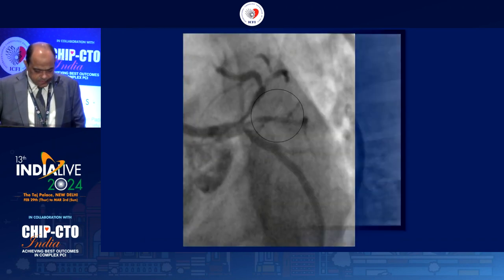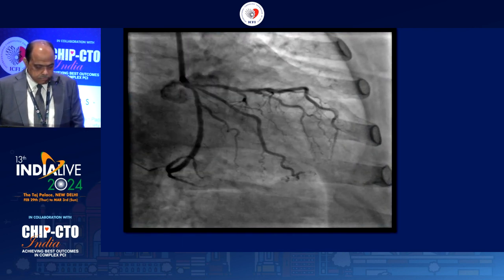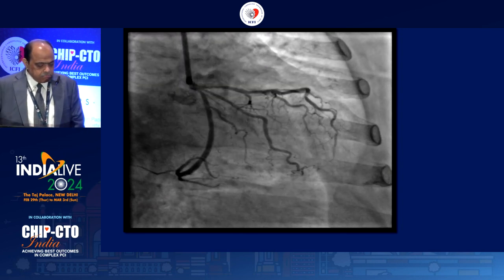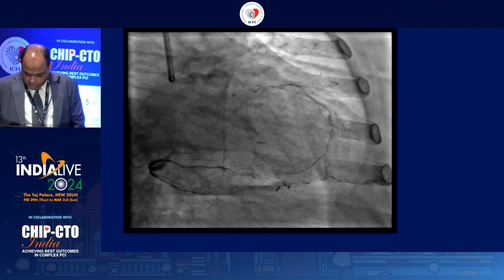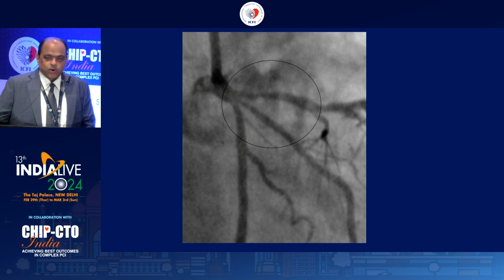I'll show you the different views, hopefully. So you can see all the three branches are involved, and all three of them are significant branches. So this is a still picture. Now you can make up in your mind what you want to do.